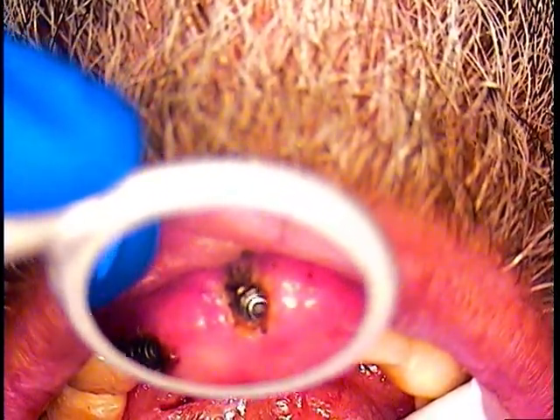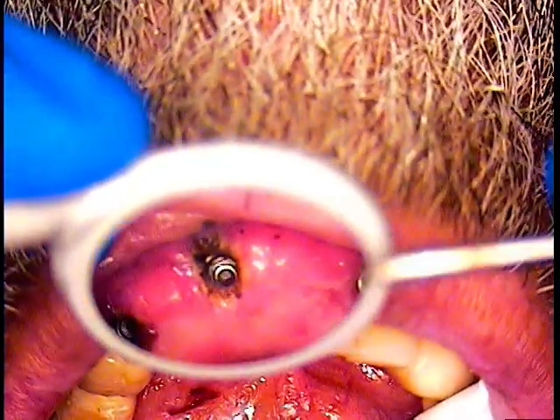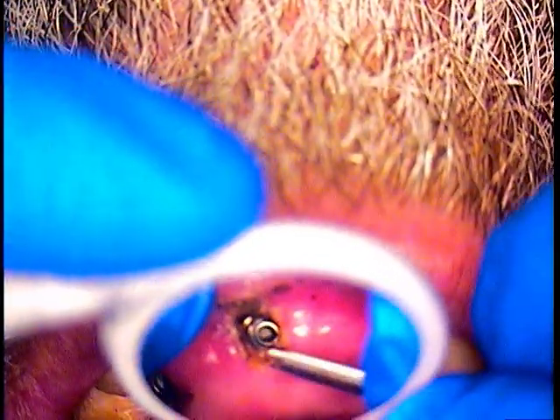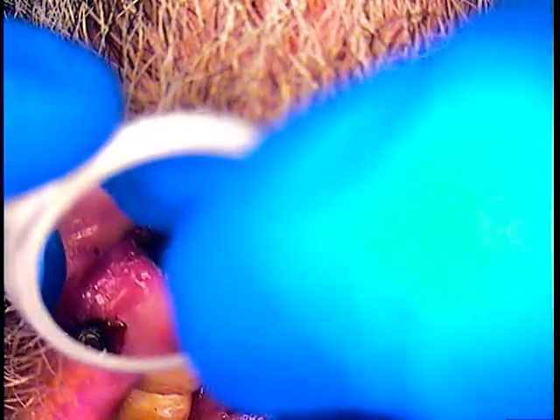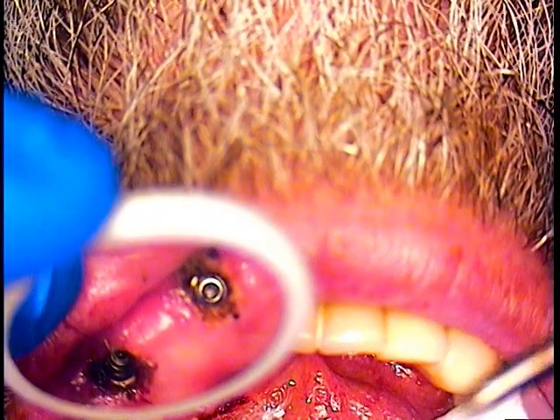All right, so that's where we're at. Again, there are all these different fragment removers. This happens to be the one that I custom make. You have to make parts. And you have to study the anatomy, the diameters especially, the threaded portion, the core portion. And this will be the next one coming out. You get the idea. Almost there.